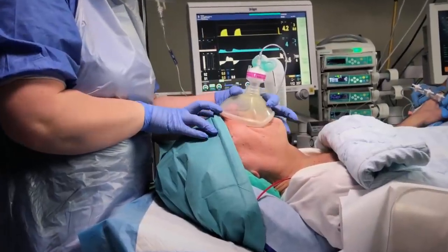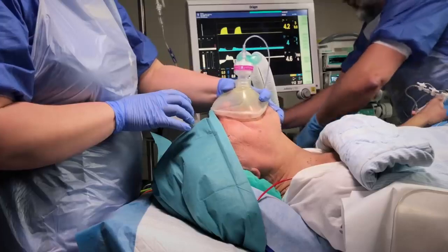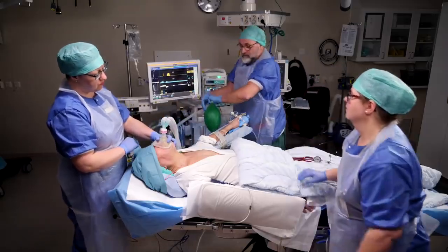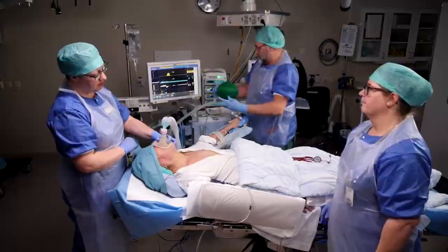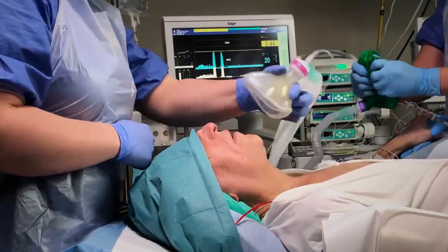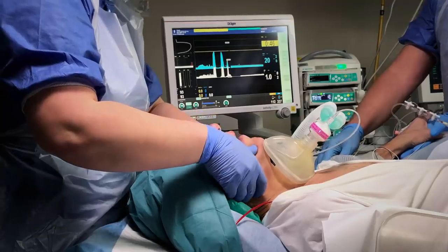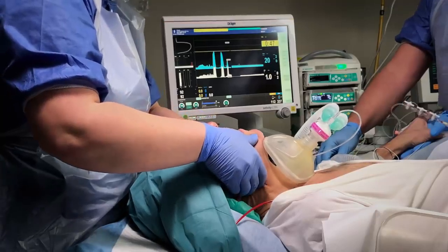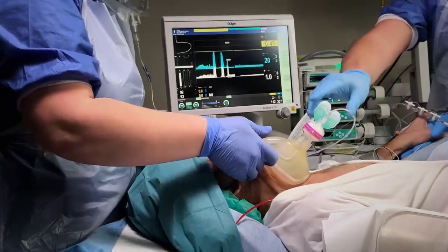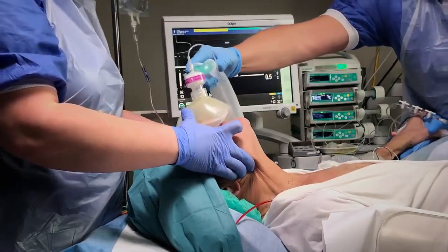Open the airways — a two-finger chin lift may be all it takes. If this isn't enough to ventilate the patient, the next step is a jaw thrust. Open the patient's mouth with your thumbs on the chin, place your fingers firmly behind the angle of the mandible, and lift straight up in a decisive manner.